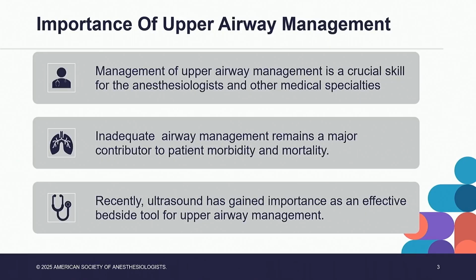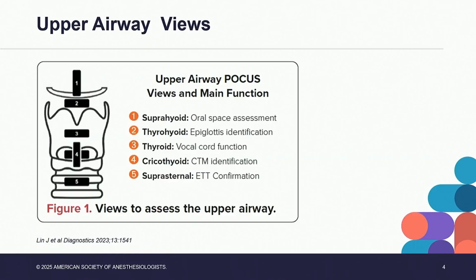So, why is it important? Because management of the upper airway is a crucial skill, and inadequate management, of course, can lead to major morbidity and mortality. And actually, ultrasound has gained importance as an effective bedside tool for upper airway management.